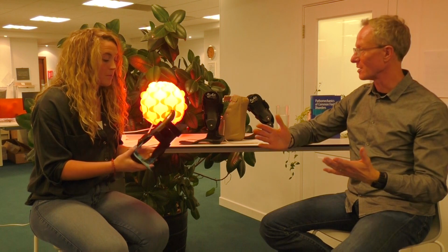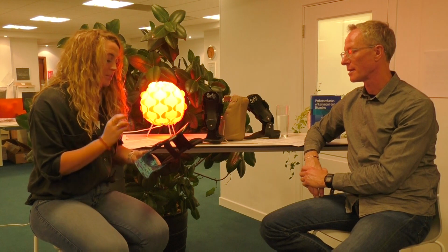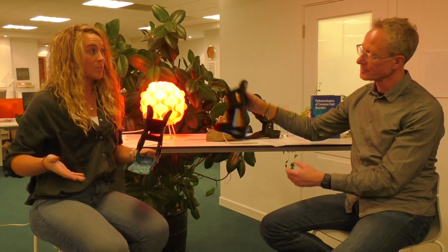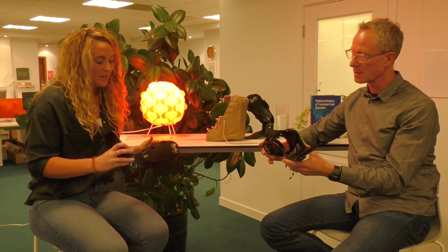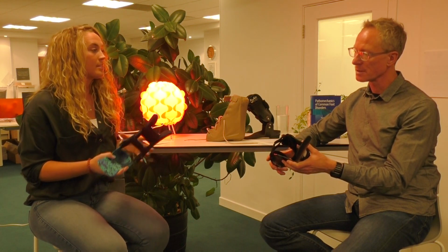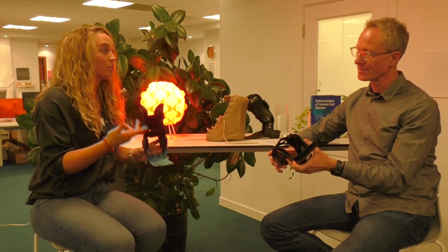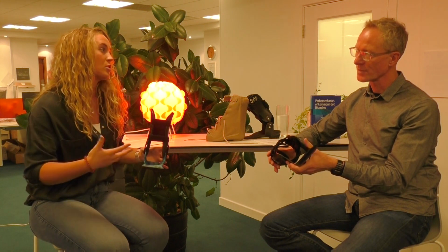But you mentioned ground clearance, so you can use this for mild drop foot. It's fixed at 90 degrees, so it will improve the position of the foot in the swing phase of gait. Exactly. When it's to do with foot drop, you want it fixed at 90 because they don't have the dorsiflexors and evertors to help with clearance. And when you're looking at degenerative joint disease, the majority of the time it's when the patient is unsuitable for surgery or doesn't want surgery, then we'll look at something like this to limit movement as a conservative treatment.